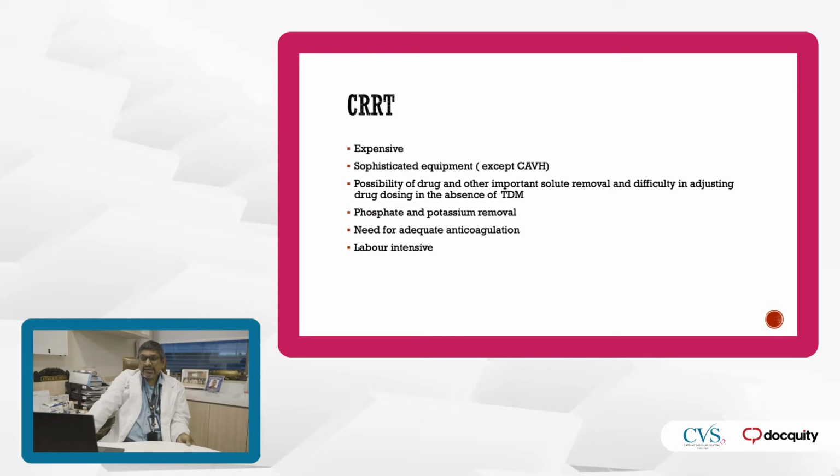In addition, some form of anticoagulation is usually required because flow rates are very slow and continuous, so they tend to clot. And finally, compared to intermittent hemodialysis, CRRT is a bit more labor intensive and takes a lot more time from the nurses, who often have to attend to the machine when it gives problems.